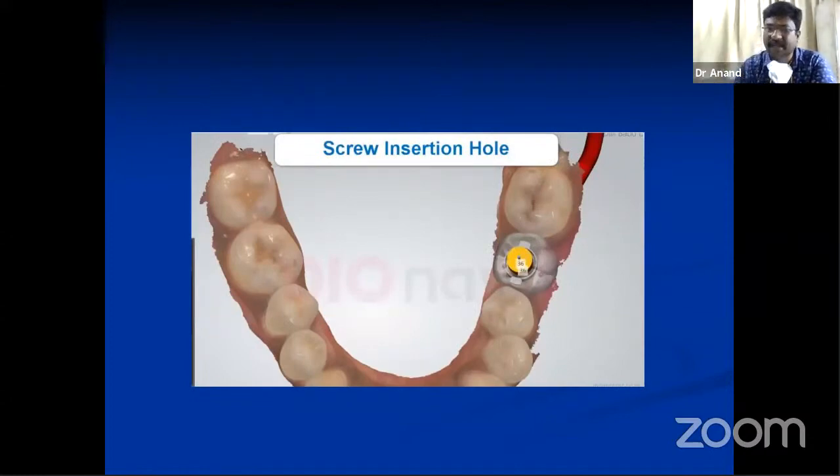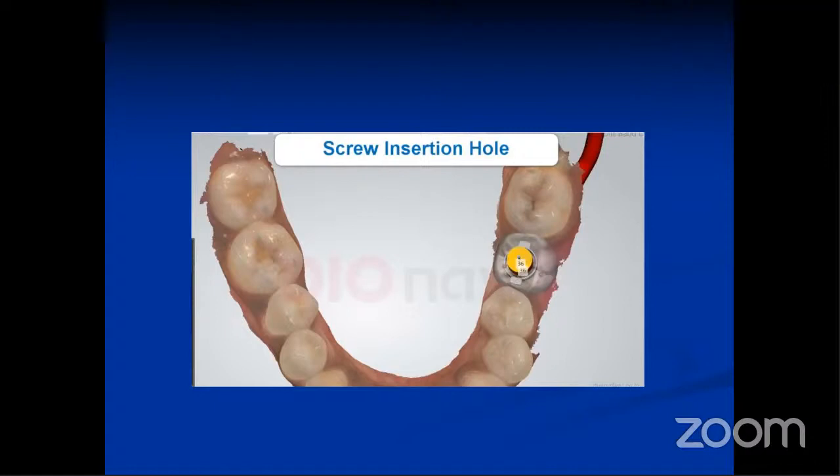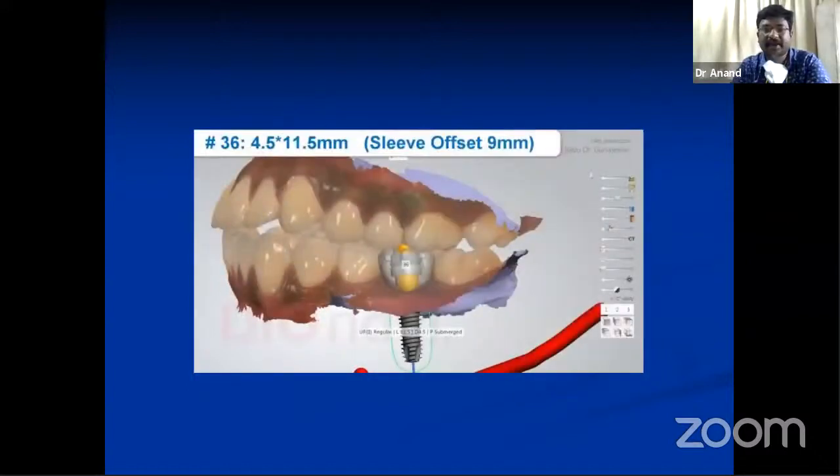So before going into surgery, this CBCT, with the help of these software, helps us know what the size of the teeth could be and what the position of the prosthetic screw axis should be. And with the CBCT scan, you also have the capability to fabricate with 3D printing. So with the help of 3D printing, you can plan it.